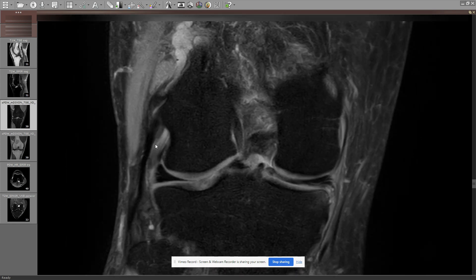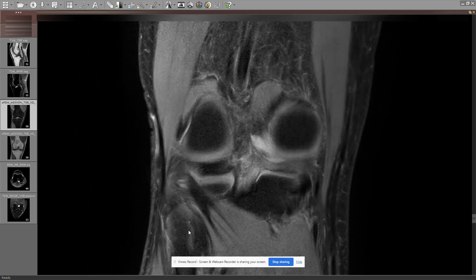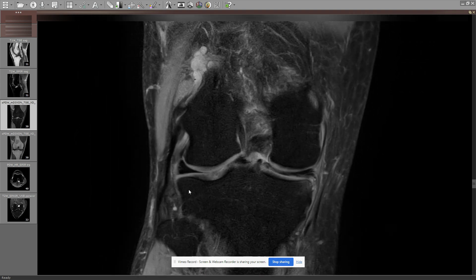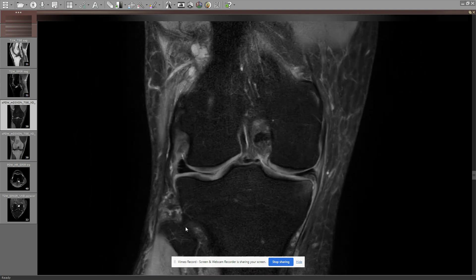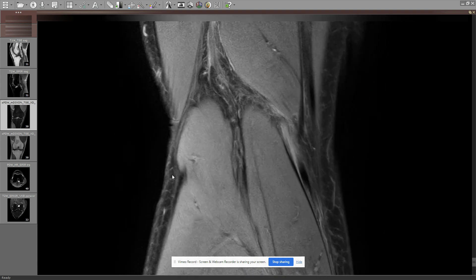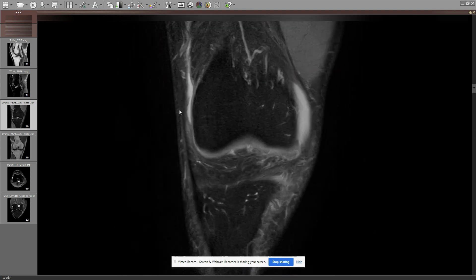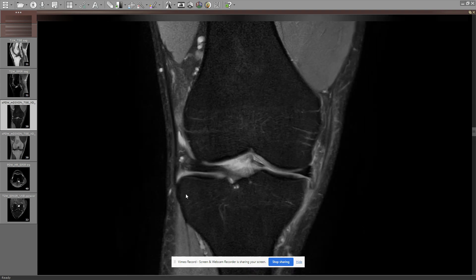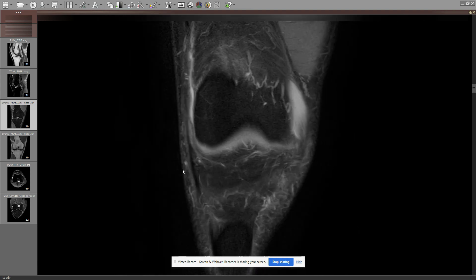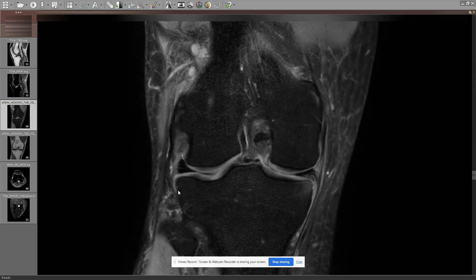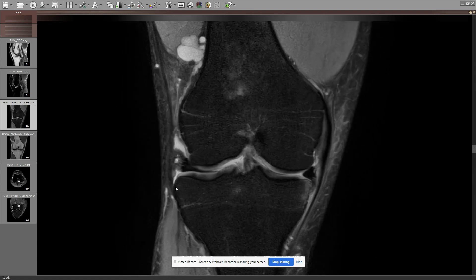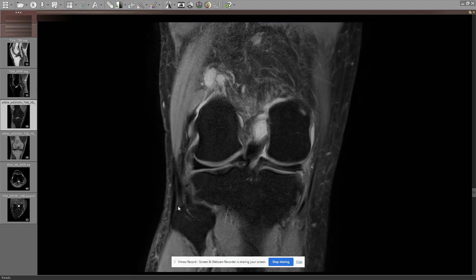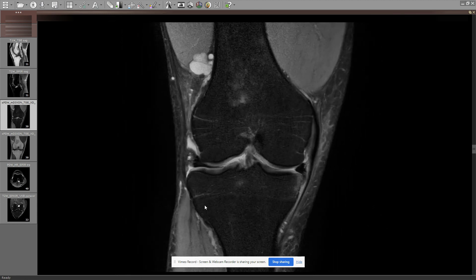The popliteus tendon — too thick, too high — so there's tendinosis. The muscle is fine. The arcuate popliteal ligament is fine. The proximal tibiofibular joint is fine. The iliotibial band is fine, no irritation. And we don't see anything wrong in the course, or the presumed course, of the lateral collateral ligament either, which I did not mention in my report.